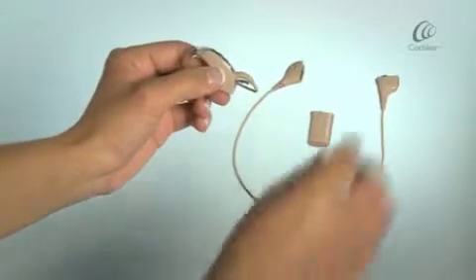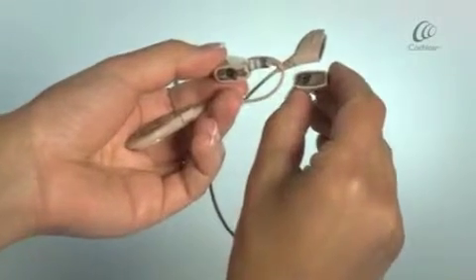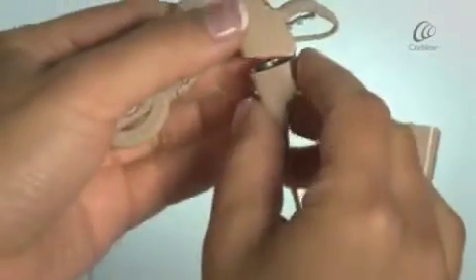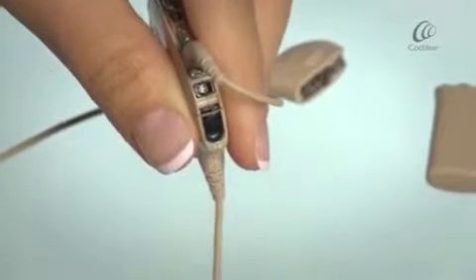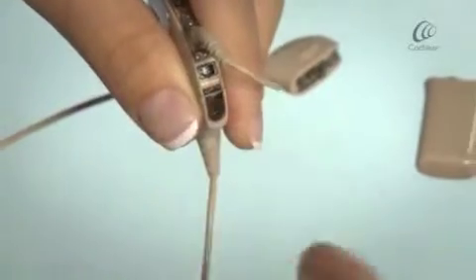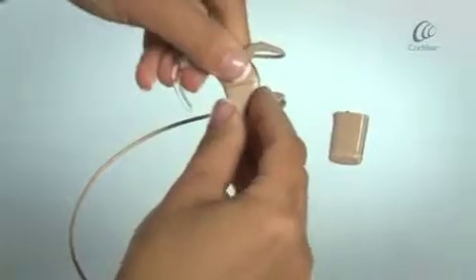Join your processor and the upper end of the Lightwear cable at an angle and then twist together. Lift the accessory socket cover and move the lock from the right to the far left position. Close the accessory socket cover.